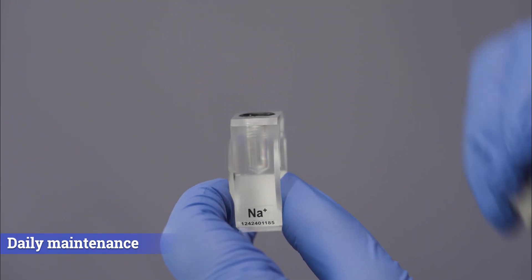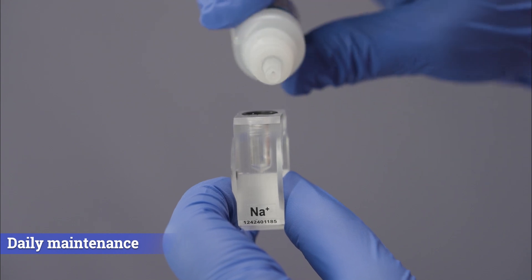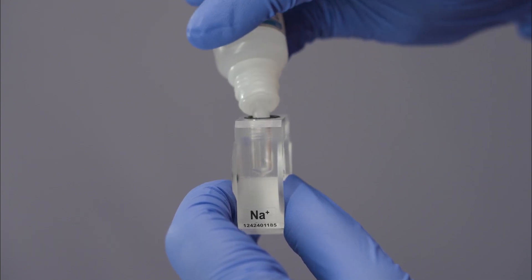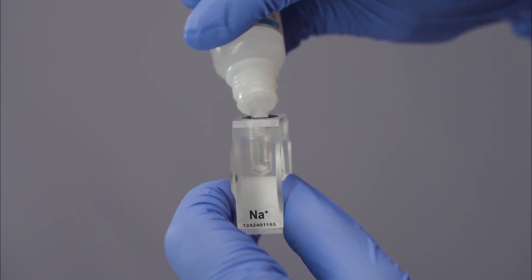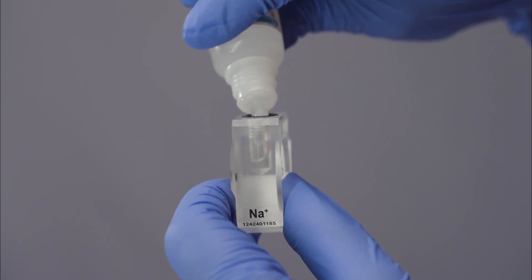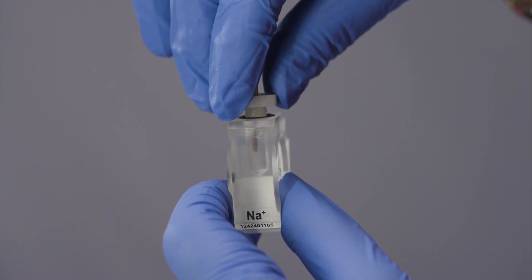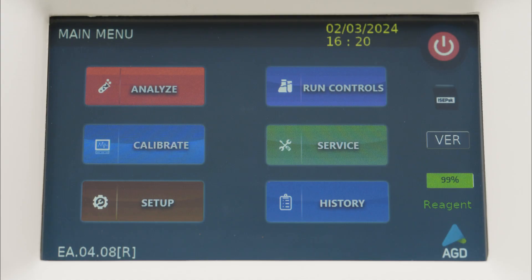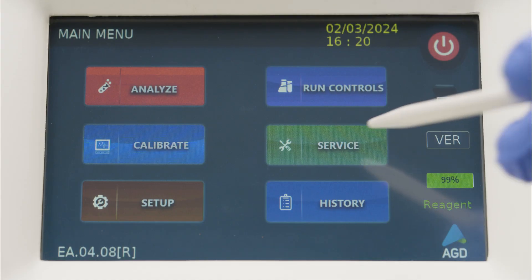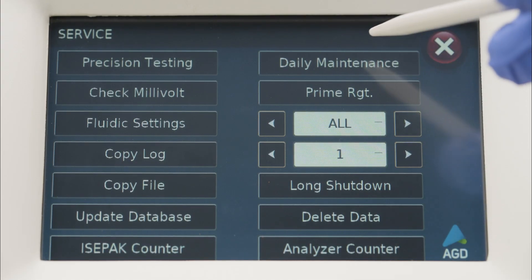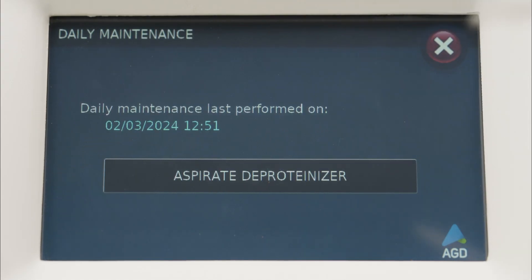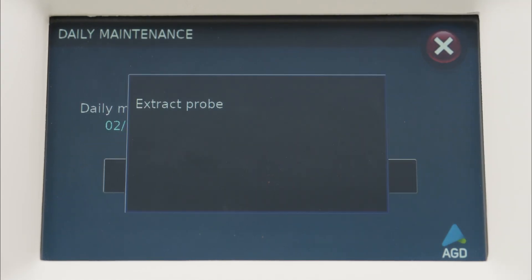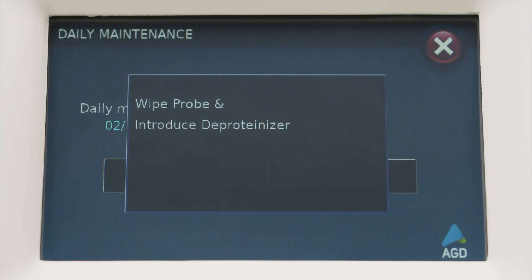Electrodes can be refilled with the internal filling solution, which increases the life of electrodes, removing the need of replacing them frequently. D-proteinizer ensures easy cleaning by dissolving proteinaceous residues in the sample path, which prevents erroneous results.